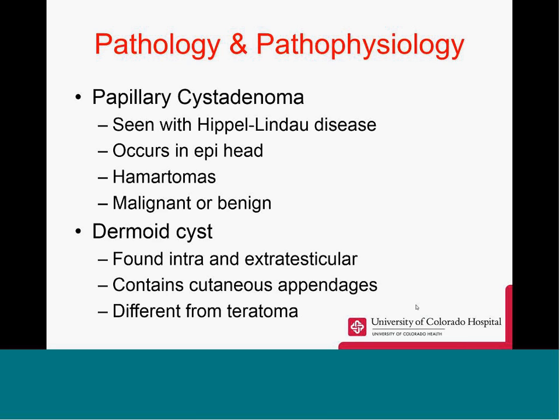Papillary cystadenomas are seen with von Hippel-Lindau disease and occur within the epididymal head. It's also called a hamartoma, and these can be malignant or benign. The dermoid cyst can be found intra or extratesticular. These do contain cutaneous appendages, and this is different from a teratoma.